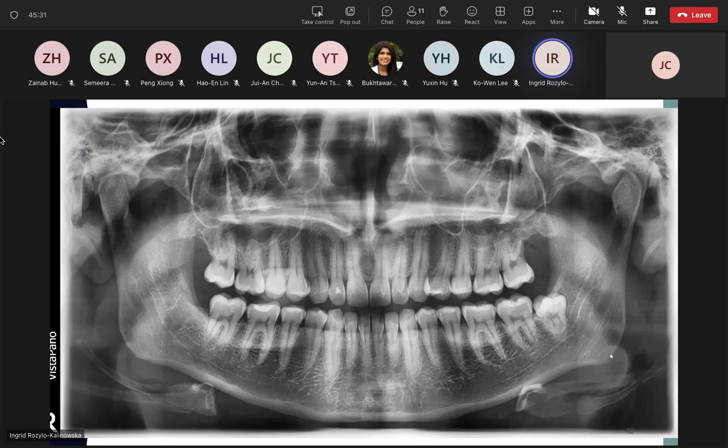But I wouldn't be too happy because with these thin slices, we on the other hand miss some detail because of a lesion, a foreign body, a plate for osteosynthesis and surgery. If they are outside this thin focal plane, they might not be visible in the resultant radiograph at all. So sometimes we miss lesions because the radiographs are just too precise.